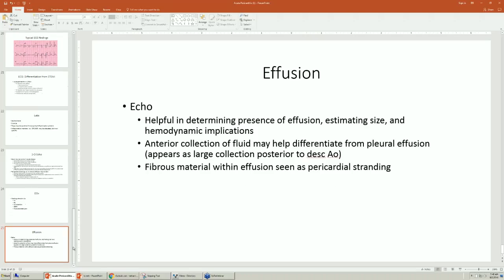And so the echocardiogram: I always take it with me in the ER when I go see a patient with chest pain. I go first to the echo room, pick up the echo machine if it's not staying at night in the ER, and wheel it with me to the ER. I've tried the handheld ones, but they're not good at distinguishing regional wall motion abnormality. So I need the real echo machine to get the kind of differentiation that I want.